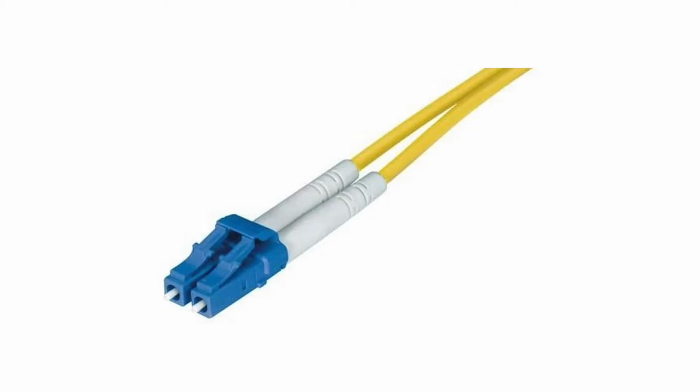One solution to this problem is to deploy fibre optic cabling within the operating theatre. This allows us a high bandwidth path between the medical equipment and the display devices. Another benefit is that if we use network technologies with the fibre optic cabling as the backbone, we can encode and decode the content, allowing us to distribute this content in the wider scheme.